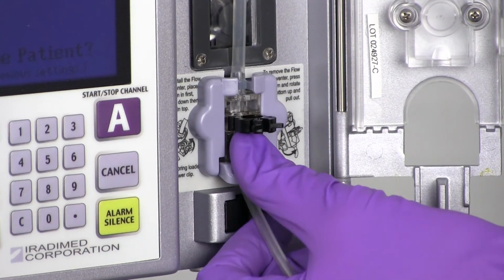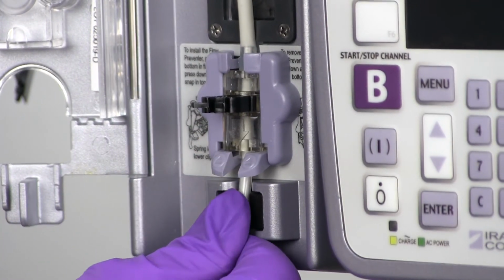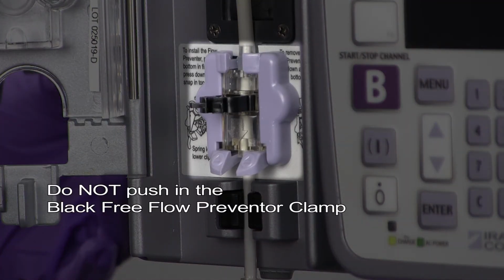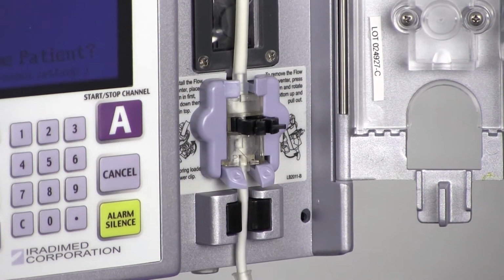The user will insert the black flow preventer clamp into the lower port by pushing down on the spring-loaded platform and then in towards the pump in a down and in motion. Once the flow preventer is installed, do not push in the black flow preventer clamp, as this may open the clamp and allow a free flow of fluids. Next, the user will position the tubing into the bubble detector by gently inserting the tubing into place.